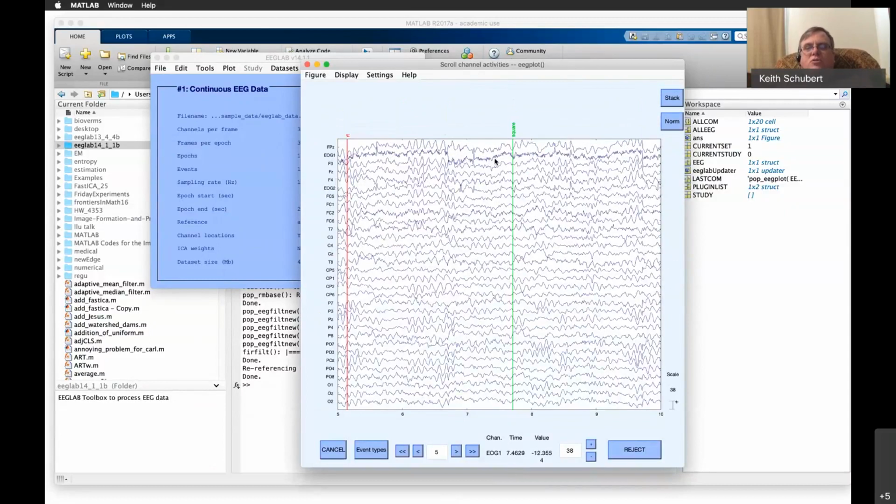So a little more muscle activity going on there. You can see it now that I've calculated the rest. This is relative to brain activity. So you can see all the EMG, instead of being spread to the rest of them, is kind of concentrated.